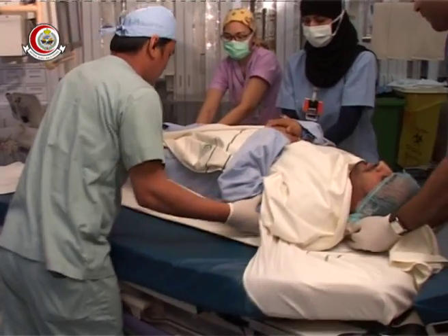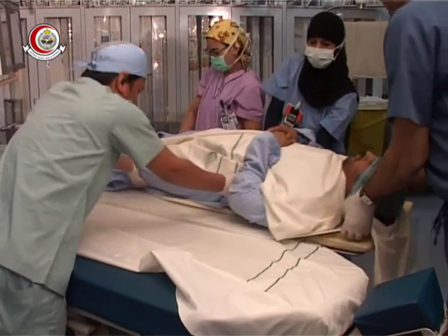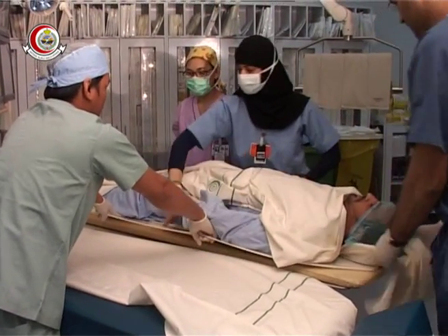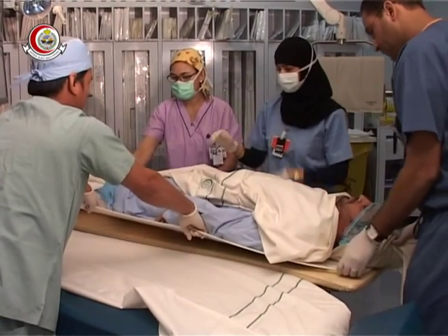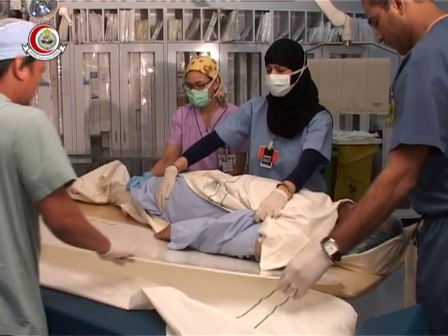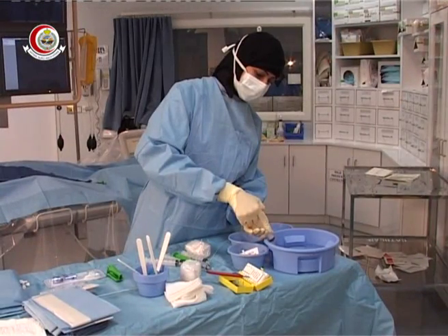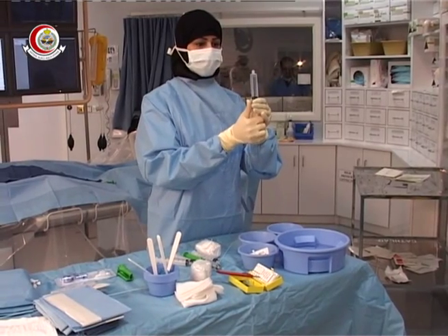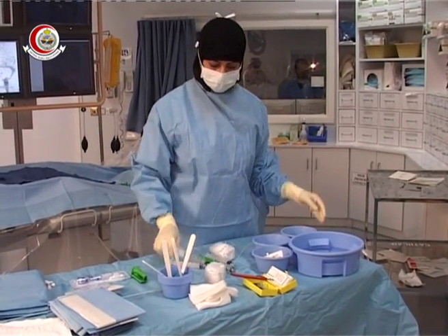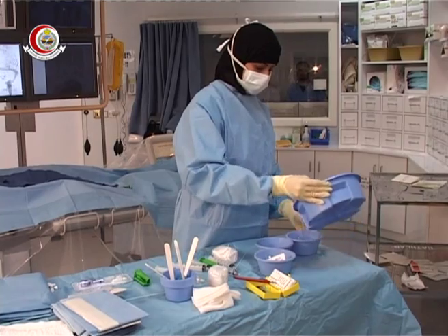Inside the angiosuite, the patient is transferred to the angiotable by the angionurse and the anesthesia team. As the patient is being brought in, the technologist prepares the table for the procedure inside the angiosuite.